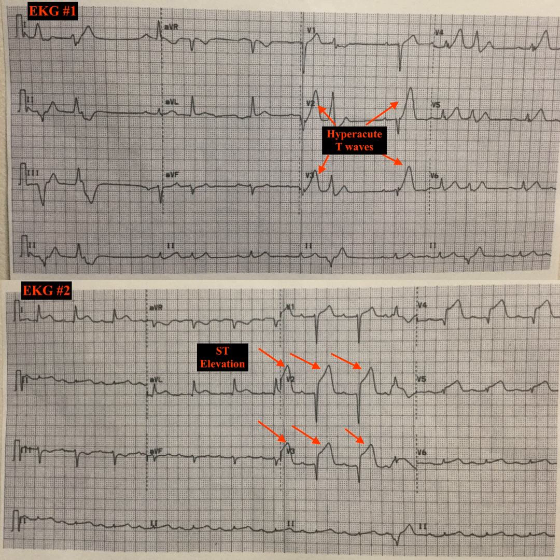So I was going to use this EKG as a springboard for discussion on the evolution of EKGs in acute myocardial infarctions. So a 55-year-old presents with chest pain, and they have this EKG. As you look at that, some things clearly pop out. The rhythm is irregular, but other than the ectopic beats, the ectopy, is there anything that you can identify there that looks particularly different?